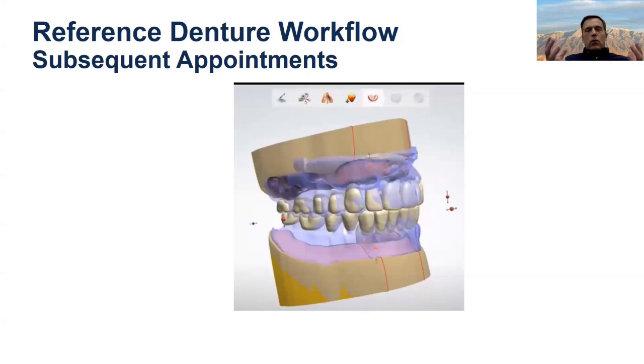In general, once we have the bite, we'll go ahead and design the teeth, get you that printed try-in, and then be able to move to finish. Again, I wanted to emphasize, get those manufacturing files from your lab and put them in your patient's digital file. That way, if you ever need another denture, you can send them to the laboratory. The laboratory can manufacture them without any try-ins or whatever. Just manufacture, assemble, and send them to you.